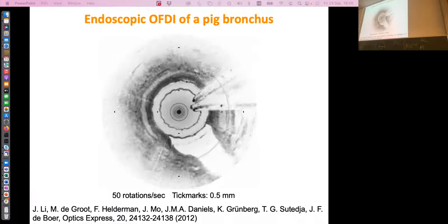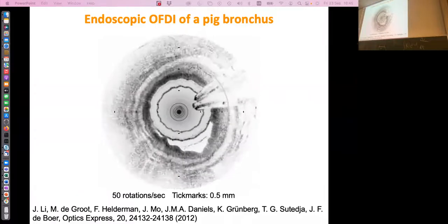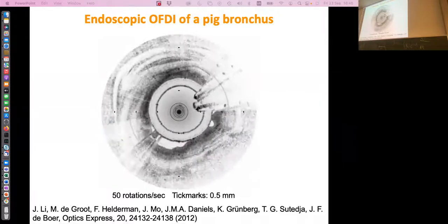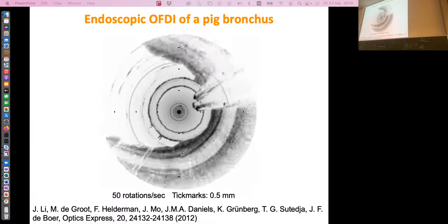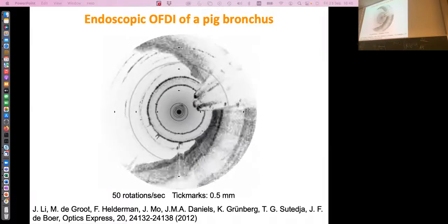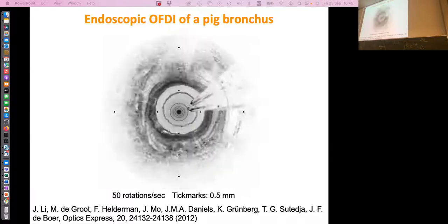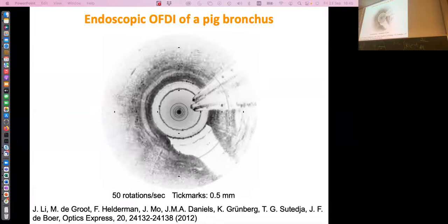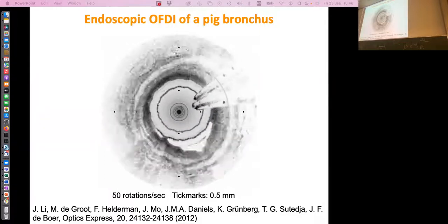What do you see with confocal microscopy? Yes, but what is the contrast mechanism? What creates the difference in signal that you measure? So you made the scan. I measure one look. What did I see? An image, right? What does that image tell you about the tissue? What is the property of the tissue that generates the confocal image? The amount of light you get, that is governed by scattering. And basically, it's a scattering contrast mechanism. The same holds for OCT. It measures scattering contrast.